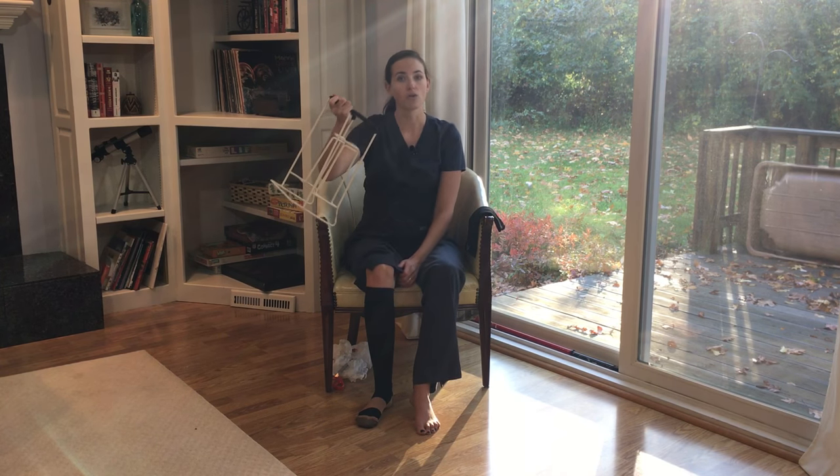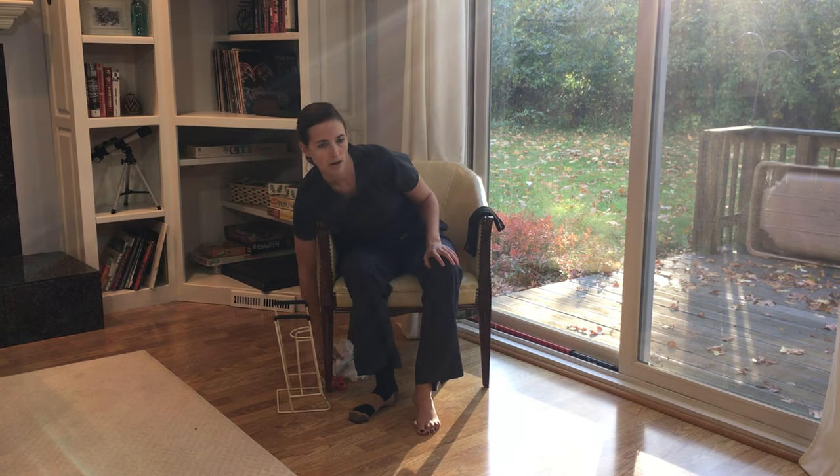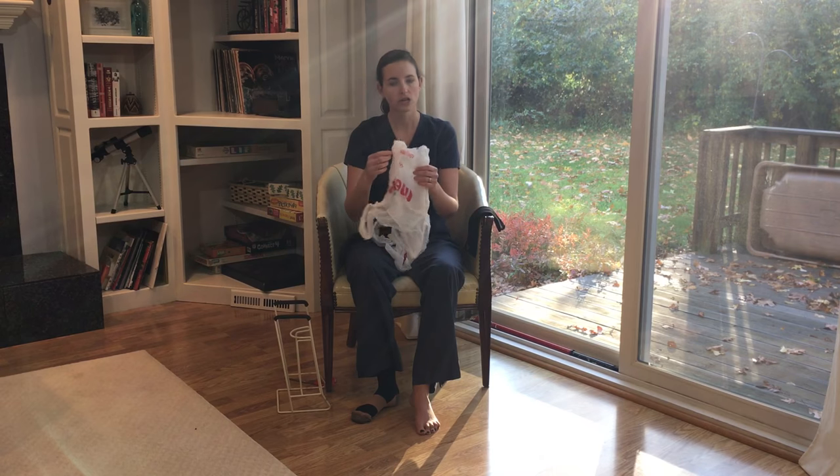Now let's say you don't have this piece of equipment at home. I have a nifty little trick that you can try that requires absolutely no tools and probably stuff you have just laying around the house. What I have here are plastic shopping bags. This is a trick I learned working in a lymphedema clinic, and it works like a charm.